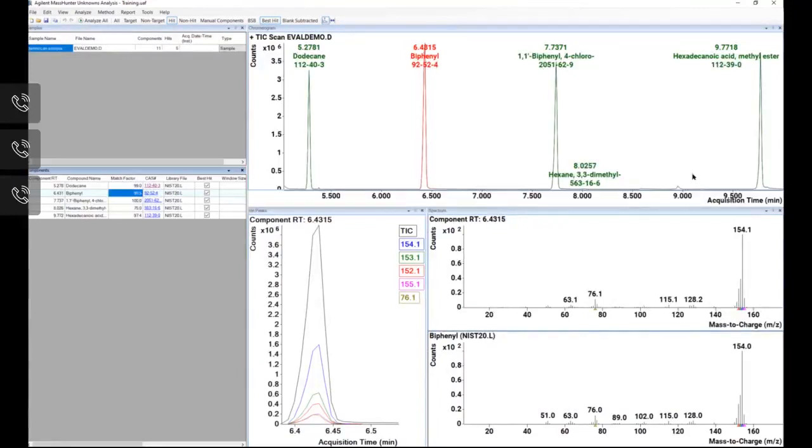parameterless integrators, algorithms that look and seek out your baseline and determine when your peaks start and stop. Very similar to what you're using when you do integrator events in ChemStation, but in this instance, they are parameterless integrators. There aren't any specific events that you can change and adjust, except as you saw earlier, we could filter by area or height abundance, but there's no skim slope sensitivity or baseline reject or any settings like that there is in ChemStation. These are algorithms that are parameterless.